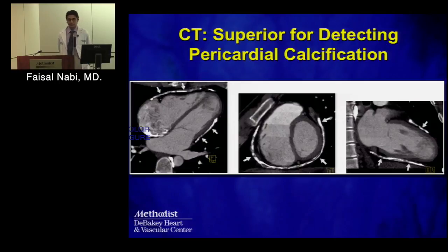And if I can take that patient to the scanner for 5 minutes, because it takes practically nothing, as long as the patient is stable enough to go to the scanner, get a picture, and come back to the ICU, that perhaps might be the way. I mentioned that because that's a practical situation. We see that in rounding all the time. And transthoracic echo at the bedside in those patients can struggle at times to give us a clear view of the hematoma, and yet the patient clinically is acting like somebody in tamponade. So that's a scenario that is worth discussing.